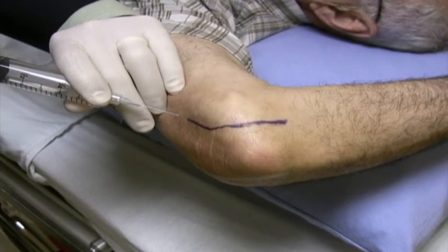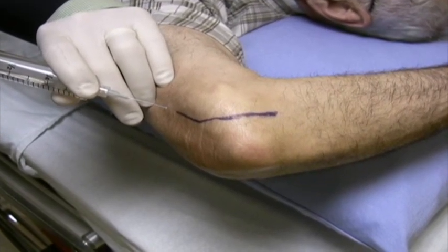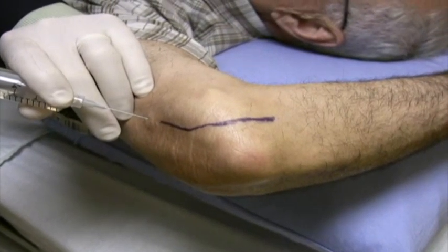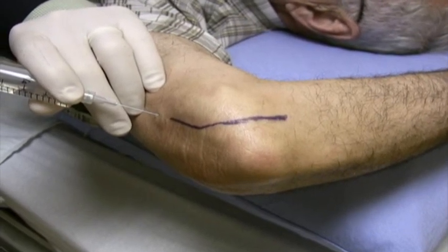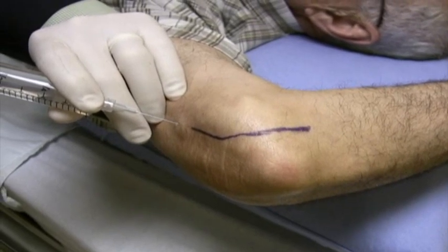Is that hurting at all there now? A bit. Okay. And then we're going to just stay parked right there because I know my needle is in a safe zone. And I'm slowly going to inject here. Is that hurting at all? No. And the whole idea is to be slow, be patient.